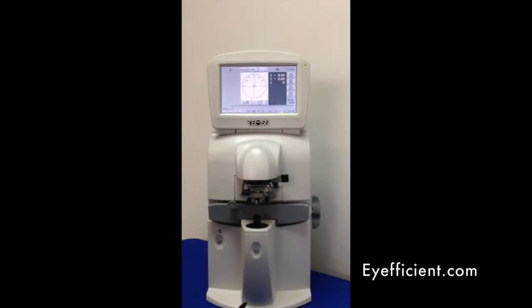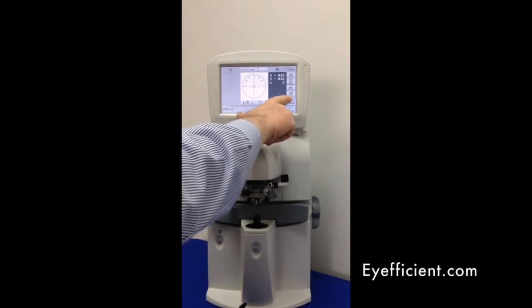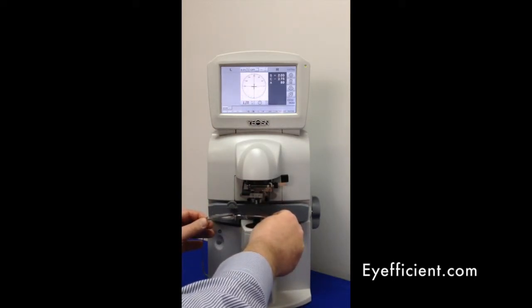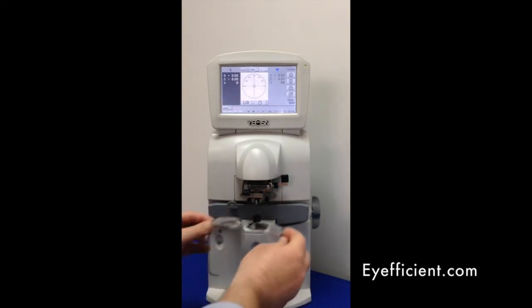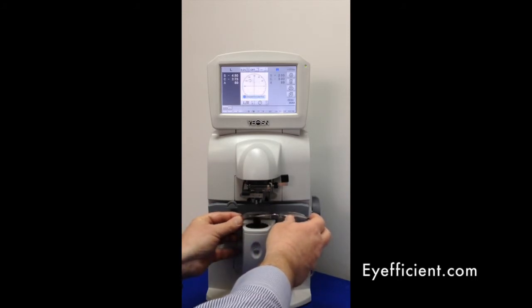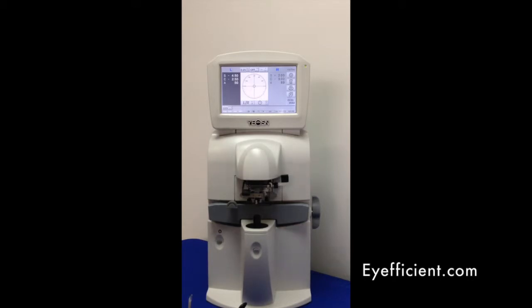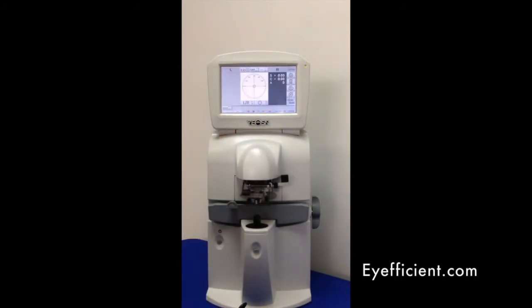Now let's measure a few pairs of lenses. Starting with a single vision pair in automatic detection mode — 'A' stands for auto — I'll put in the right eye of the glasses and find the optical center. It turns blue, grabs it automatically, memorizes it, then switches to the left eye. I put the left lens in, go to center, it finds the optical center, turns blue, and beeps. Both readings are now saved, and I can print, delete, or send to EMR. I'll delete that using the trashcan button.